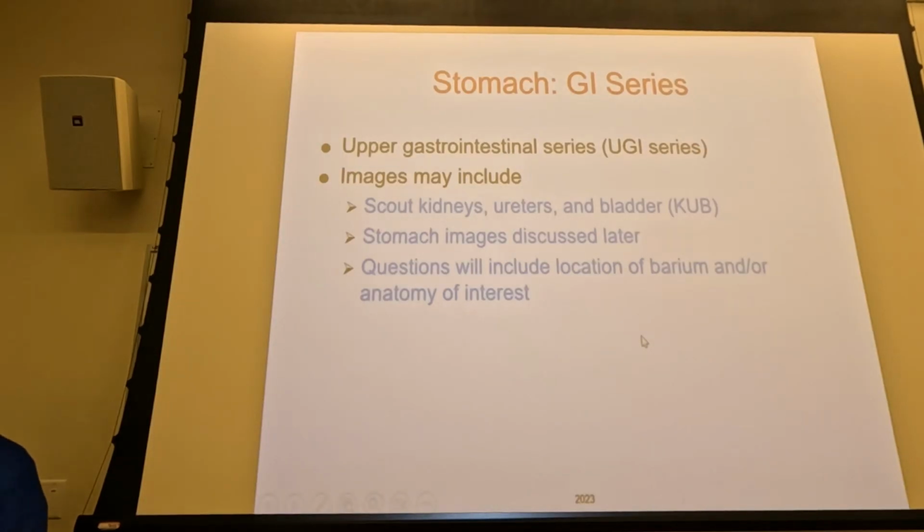Those are the most common ones that I've personally seen. Okay, so GI series is just a series for the stomach itself. So you may have an esophagram, upper GI. Very common to have both of those.